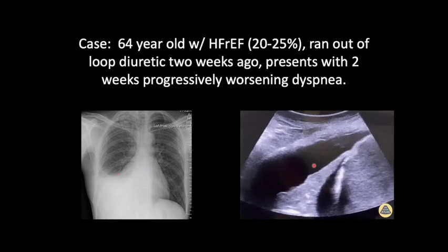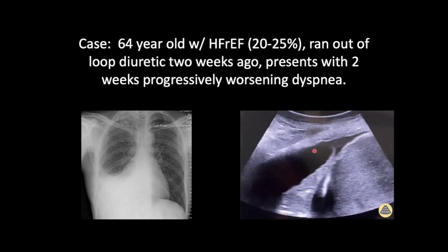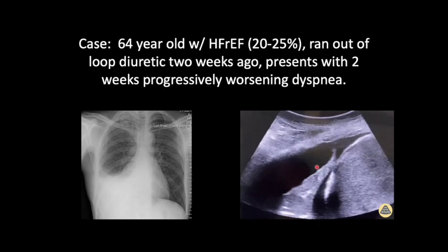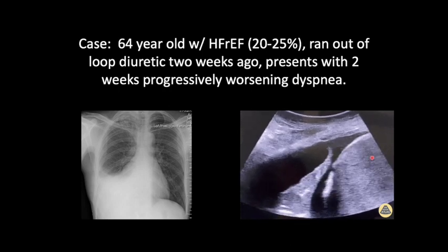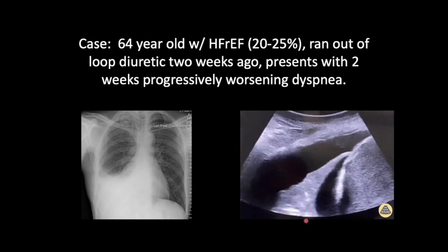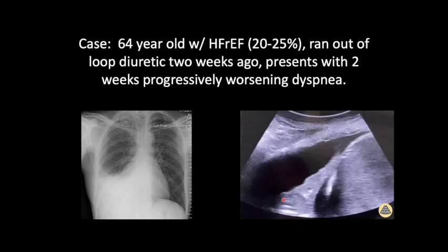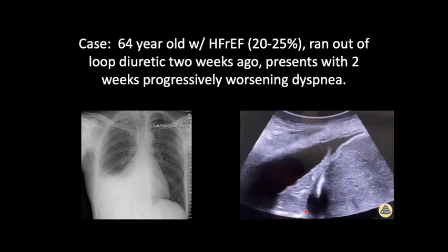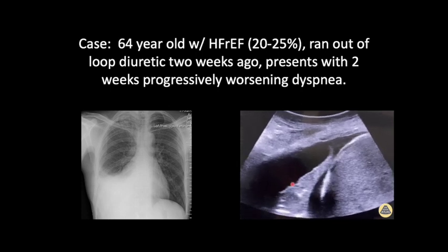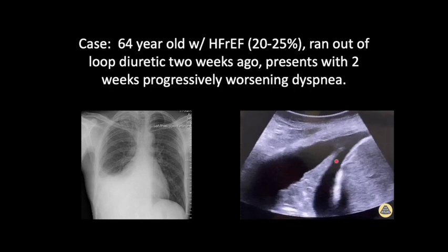And then when we do an ultrasound of this, what we see is loss of those A lines, but instead an anechoic collection, which we can suspect is fluid here. This is our diaphragm and the liver. And then what we're actually seeing is atelectatic lung that looks like a little jellyfish wiggling around in a fish tank. This is the compressed lung that we're able to see because all of the air has been pushed out of it by compression atelectasis from the fluid that is seen here as pleural effusion.